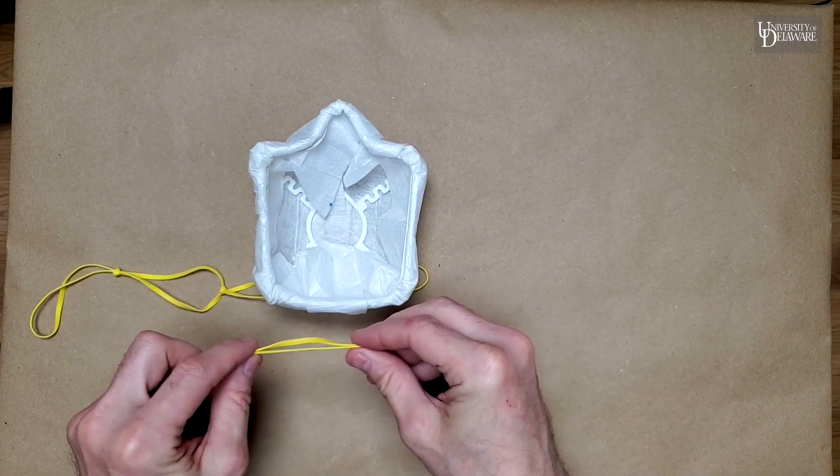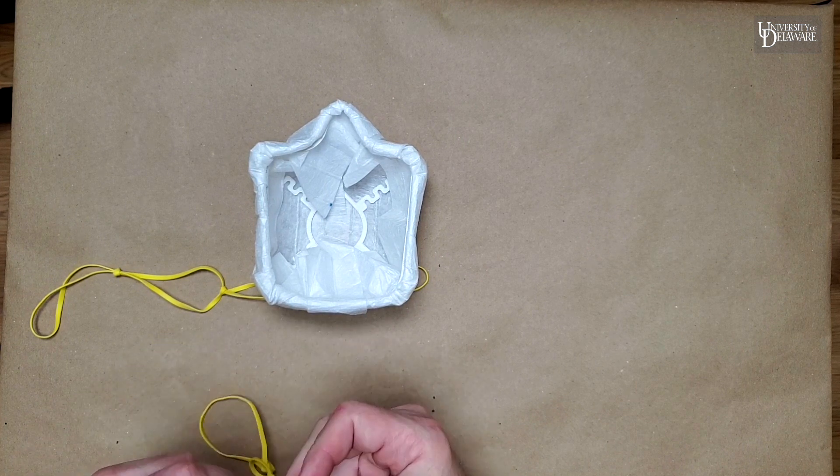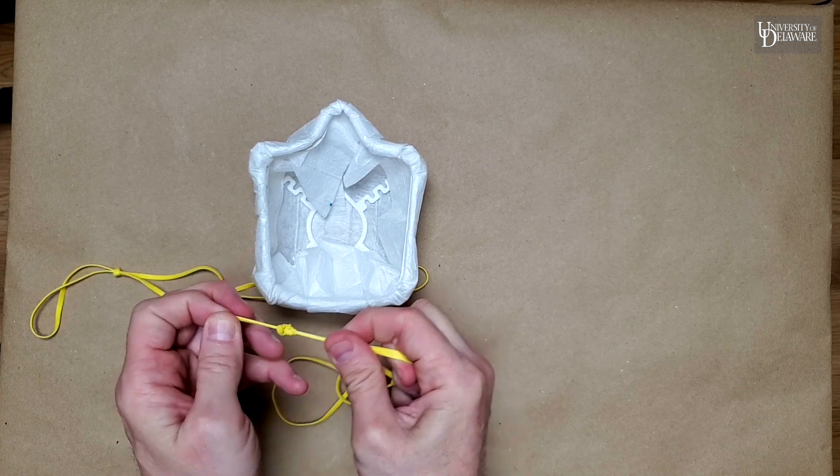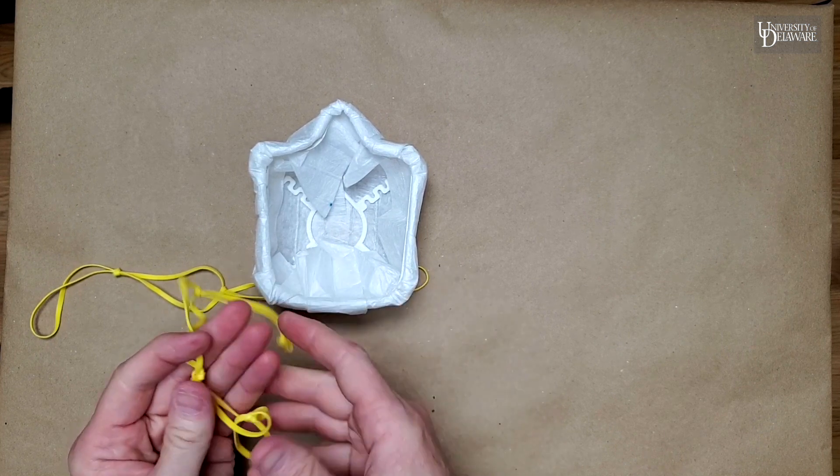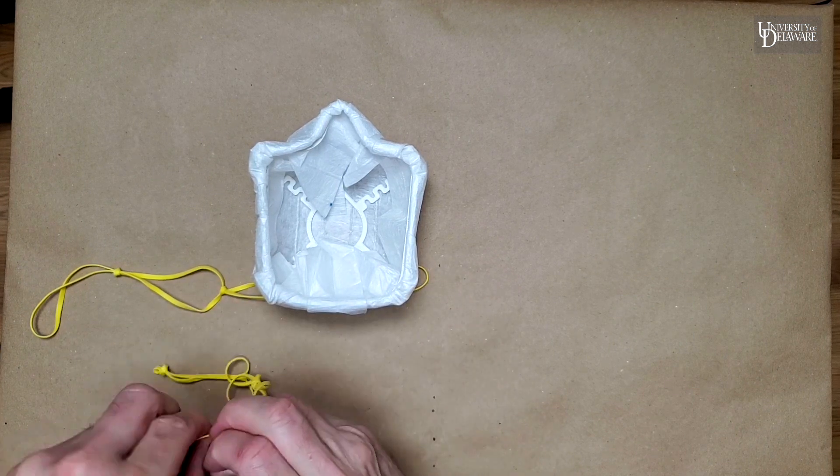And what I do with the ends of these is just grab a tiny little bit of it to stretch a really small loop. And that really small loop is going to help it stay on the horns at the four corners of the mask, which I'll show you in a minute.